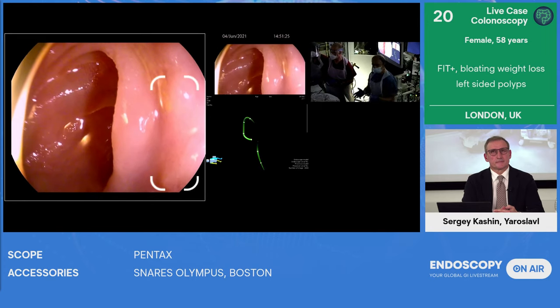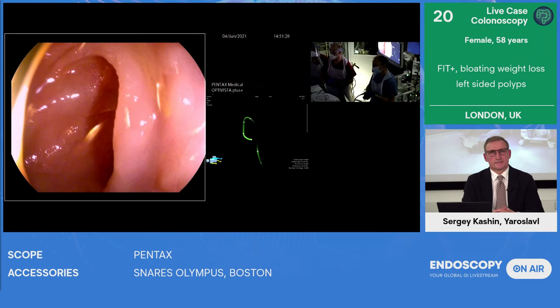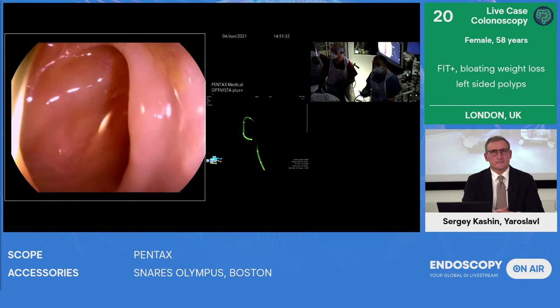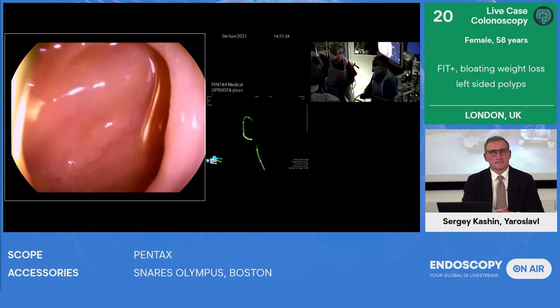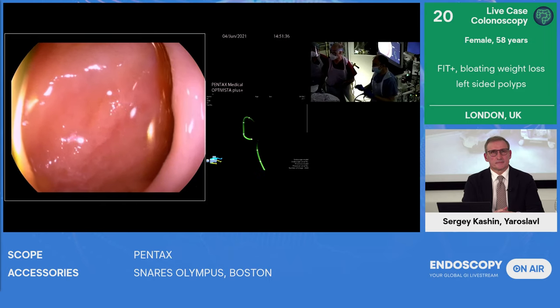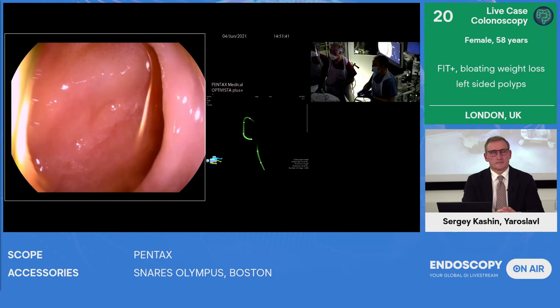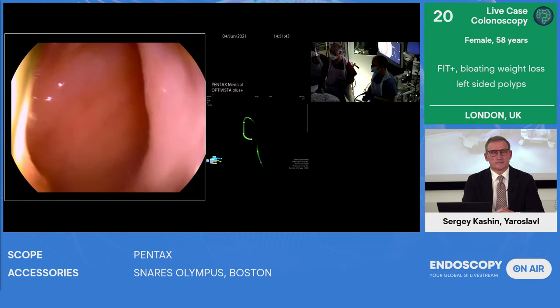But about 20% of the time, there are going to be polyps there. And then you're into a discussion about what you do with those polyps. And obviously, if the patient's very elderly, you can afford to leave diminutive polyps. But for a patient in their 50s, personally, I'd feel uncomfortable leaving adenomas in situ.